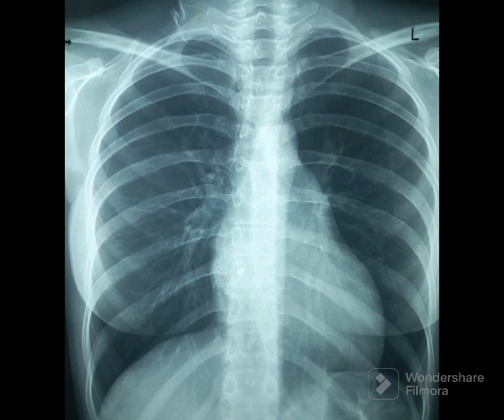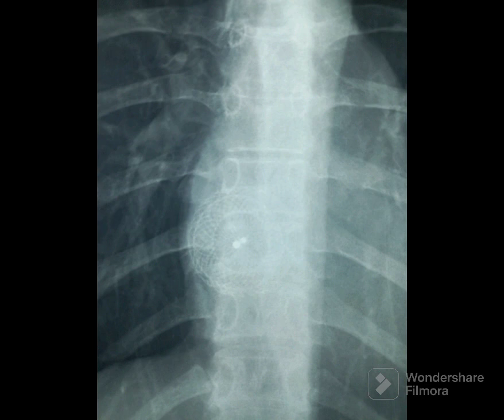Focus on the cardiac shadow. You may note a round interwoven mesh sort of device with two central dots near the right heart border. Focus on the area near the right heart border in front of the spine. You can see the device there.